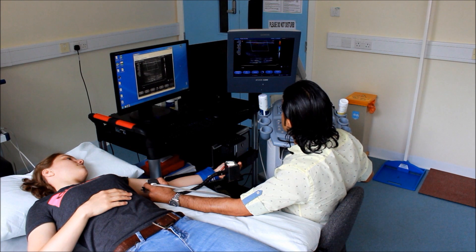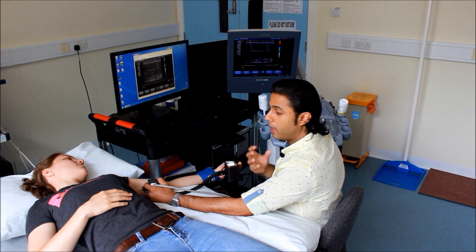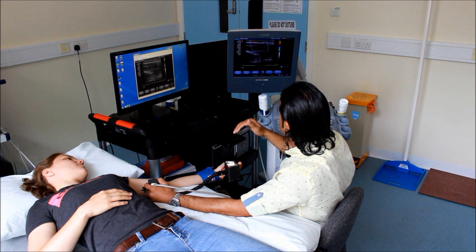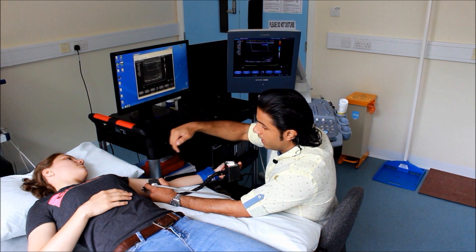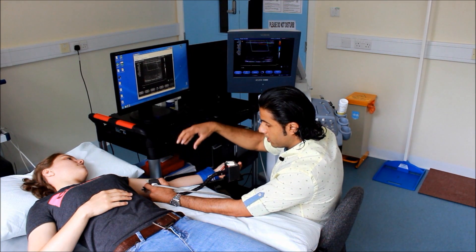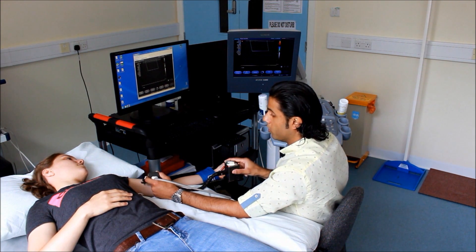You would adjust this green box which is the region of interest. What you can actually see is two colours: blue and red. Remember the mnemonic BART — blue away, away from the probe; red is going towards the probe. This tells us the direction of blood flow. As blood is being pumped from the left ventricle of the heart it's coming towards the probe, which is the red colour. The blue colour means it's going away from the probe towards the microvasculature of the forearm and hands.